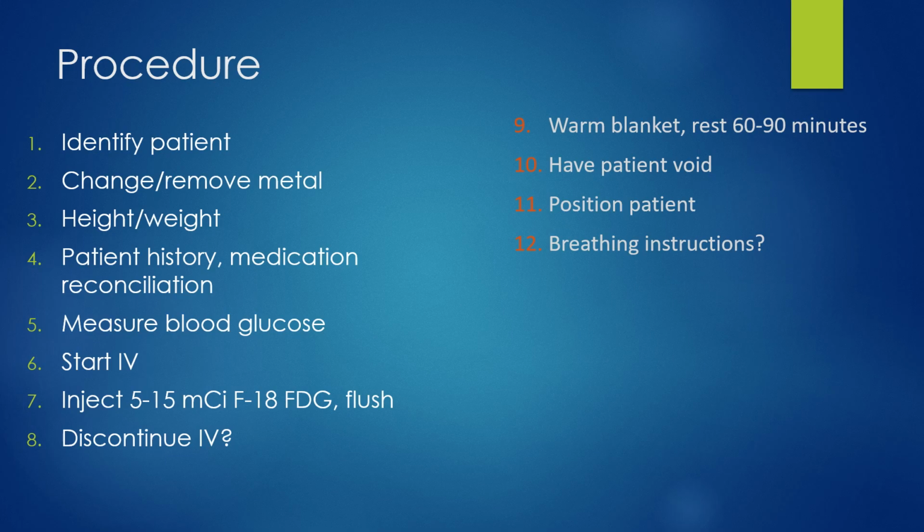And a lot of times when you start the procedure, some patients may think that they need to take a deep breath and hold it because they've had a lot of CT scans in the past. And so you can tell them that they can breathe normally or that they're going to have breath holds. Make sure you let them know what to expect with their breathing.